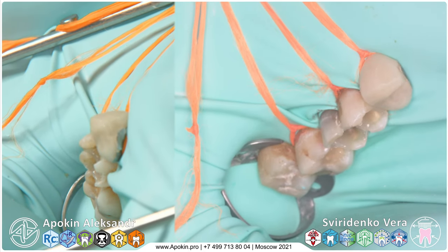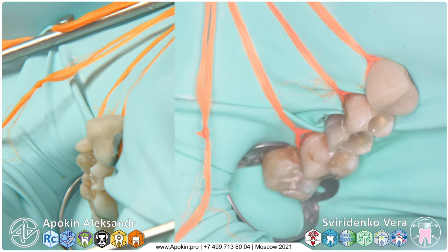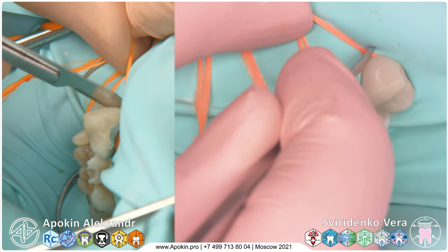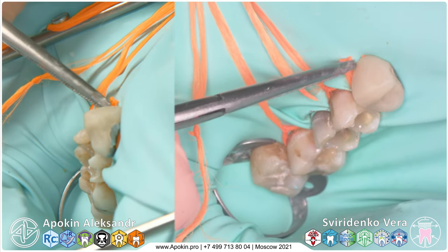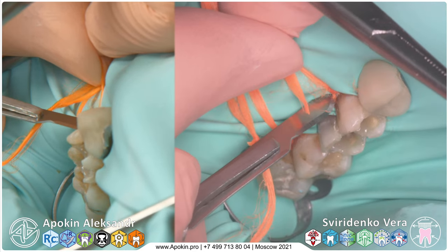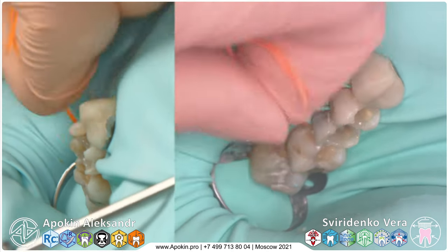Then we remove ligatures. That's this one. We remove ligatures. The fastest way is to cut them, but be very, very careful. Cut this part, not this, because you leave all this ligature inside around the tooth. Such way, this is an error. Today this is not an error, we remove it very easily, but during your regular work remove it the right way, such way. When we cut them, it's removed very easily. Very good.